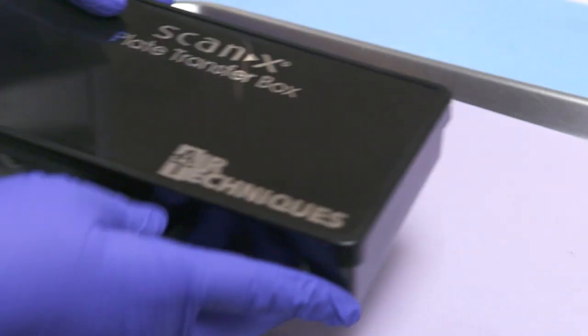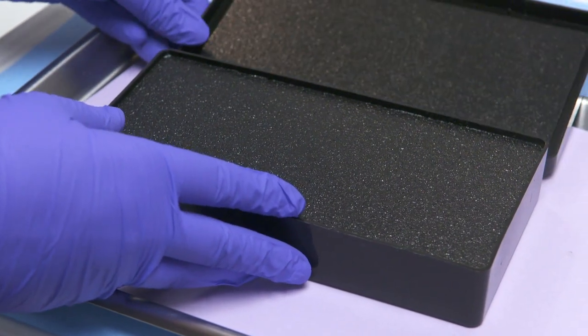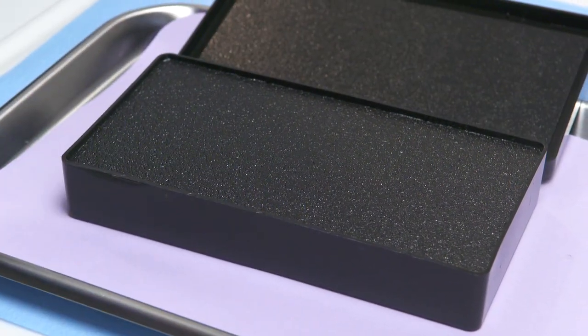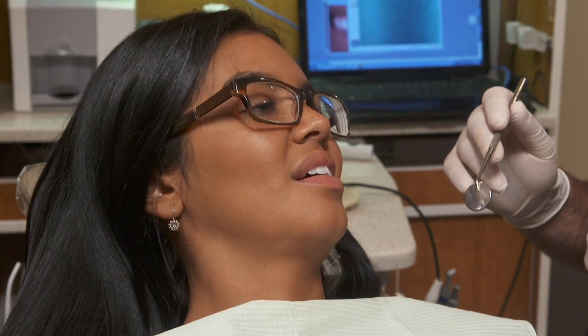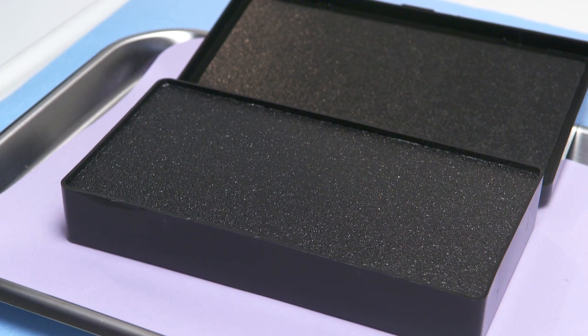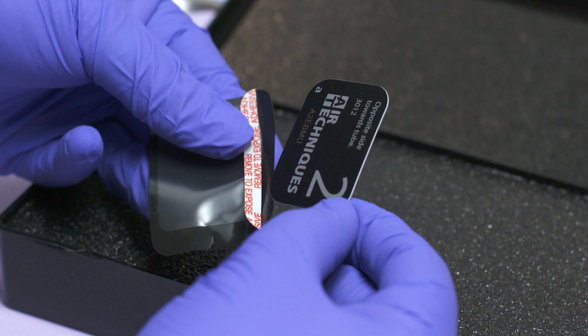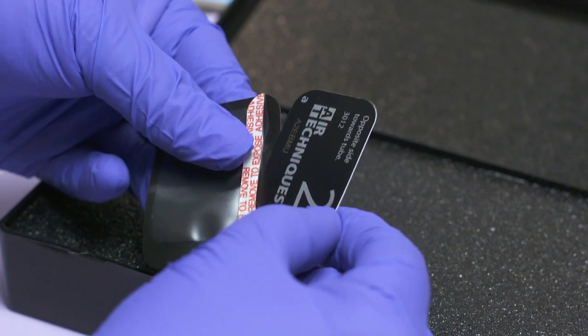Use the transfer box to store the flexible sensors until you're ready to scan them. Open the transfer box before interacting with the patient and exposing the sensors. This will prevent cross-contamination. You do not want to touch the box with your used gloves. For patient safety and hygiene, place the sensors in a barrier envelope prior to use.